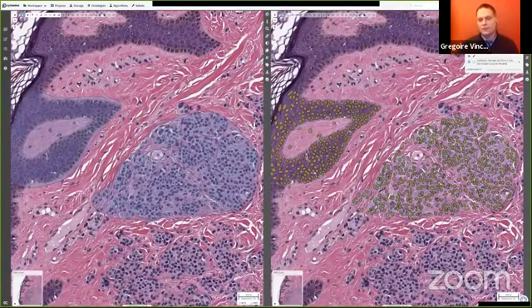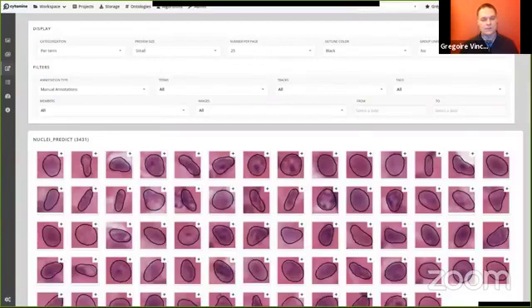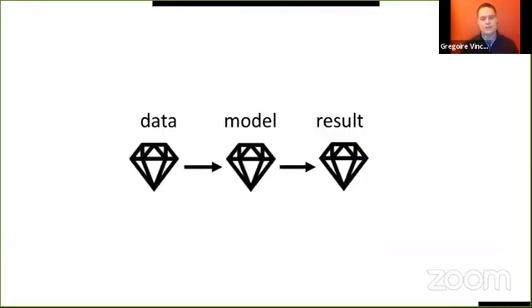And in green on the right side, you have all the nuclei of the cells that have been identified by the AI, for example, and based on that, it can calculate metrics like the number of cells, number of cells by surface, number of cells in mitosis, and so on, to give some information to the pathologist to be able to bring his diagnosis. But the diagnosis is still the responsibility of the pathologist, and you also have to give them some tools to sort the results, to be sure that they really understand and give all the metrics that they need to build the diagnostic.